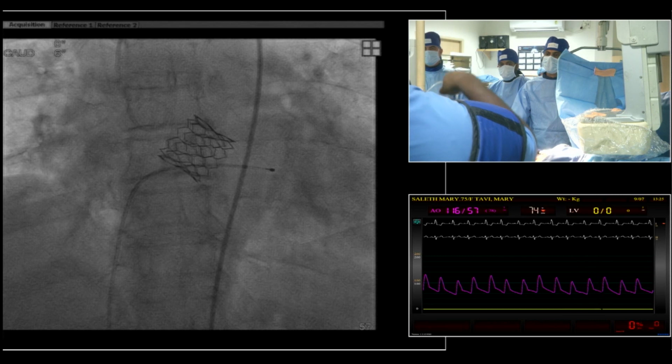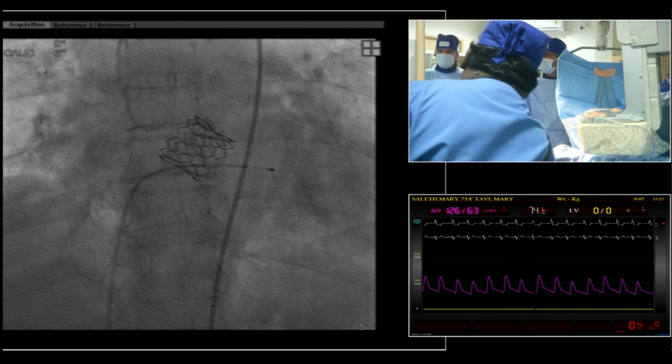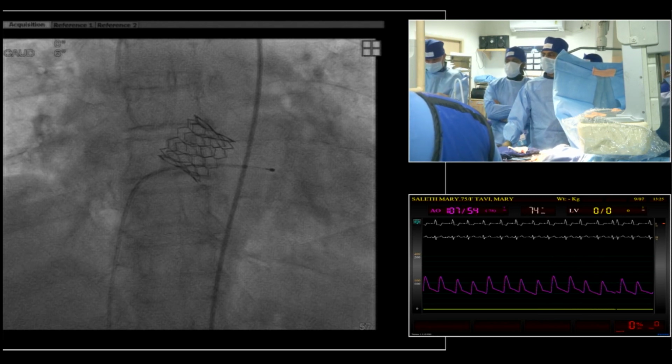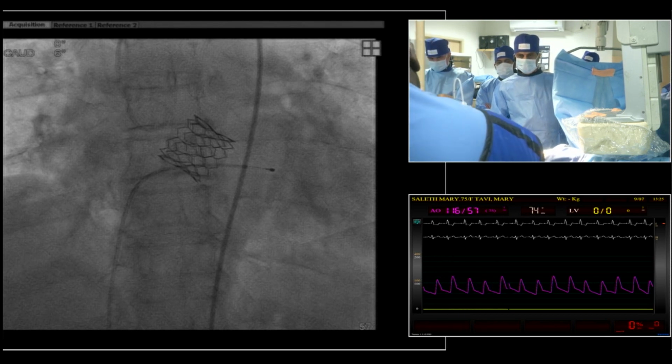And the risk of pacemaker is relatively low with this MyValve. The patient would recover by next day. It seems to be 4 or 5%. But I think you've got to be safe. Remember, you're all in your early cases. You can't just go; you actually have to be avoiding every complication.